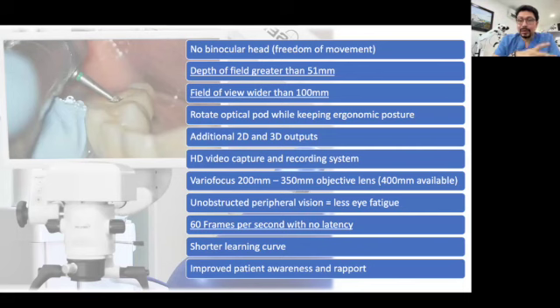For doing general procedures, we are going to work under the second or third step most of the times, because working in that magnification will provide you a good field of view and a good depth of field, and you are going to be in focus all the time. If you are working under the highest magnifications, you can have the tooth in focus, but maybe the burr in your handpiece is not going to be focused because the depth of field is going to be very small. So this is a good clinical tip.